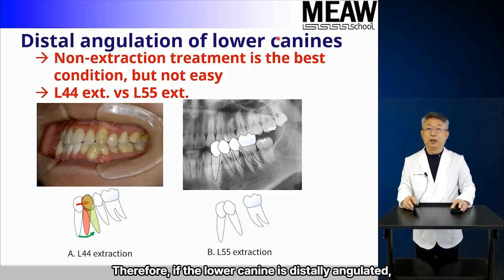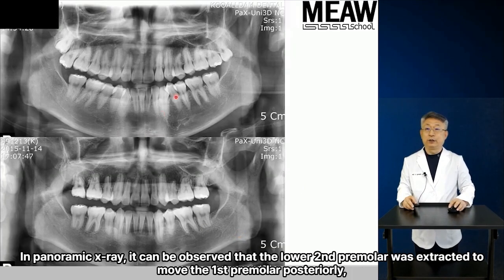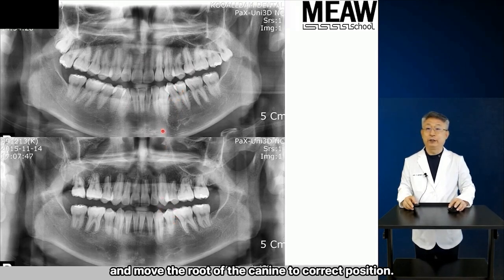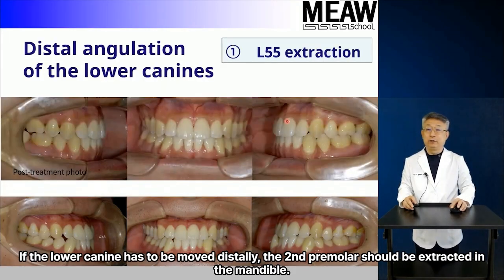Therefore, if the lower canine is distally angulated, I believe that it is advisable to extract the lower second premolar, move the first premolar posteriorly, and move the root of the canine. In panoramic X-ray, it can be observed that the lower second premolar was extracted to move the first premolar posteriorly and move the root of the canine to correct position. Let me emphasize again, if the lower canine has to be moved distally, the second premolar should be extracted in the mandible.